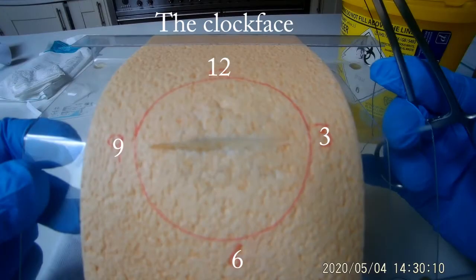Now imagine your wound is a clock face. Either end of the wound is number three and number nine of the clock. The top is twelve and the bottom is six, just as shown.